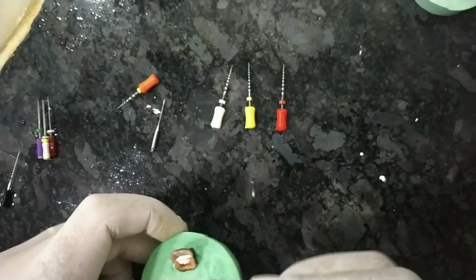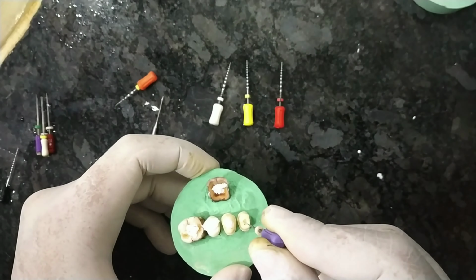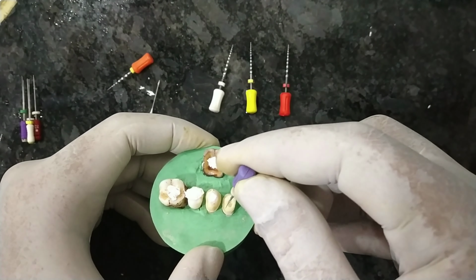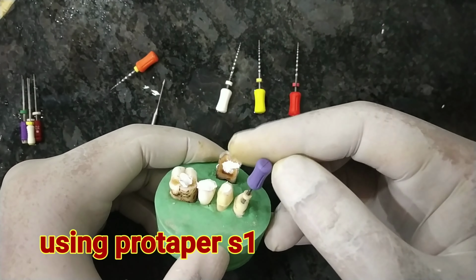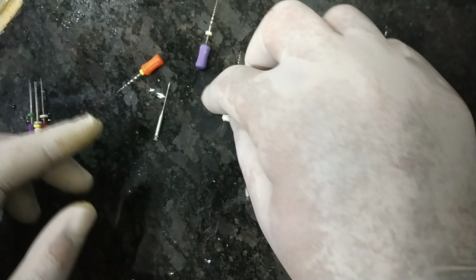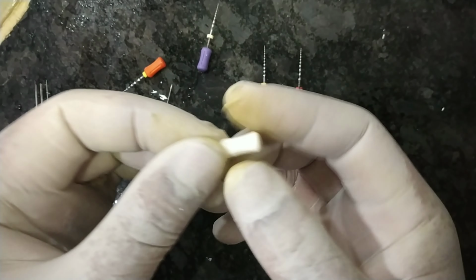So this is our tooth. We have to set the measurement. We have to shape it. Shape it, both the canals. One canal 18.5, the other one 19. Shape it like this. Then same S2 file.